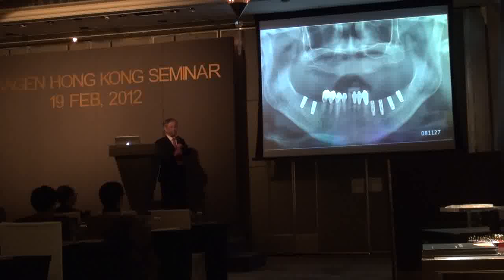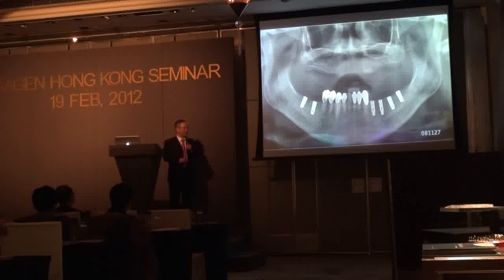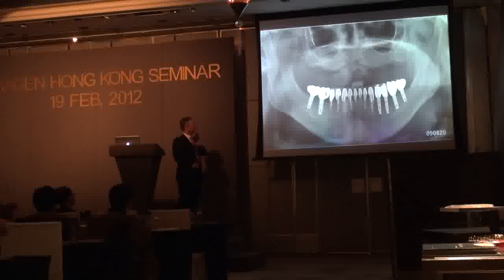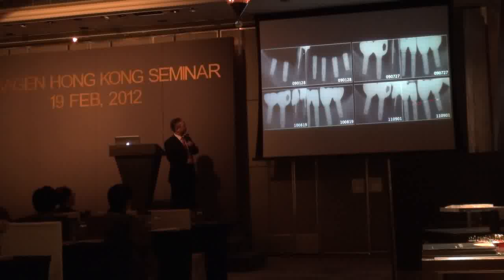So this is one of the first cases with X-Speed treatment. This was started in 2008. At least 3 years have already passed. We tested because the surface change is very, very critical. And with a very nice, very stable result, almost 3 years later, as you see, very stable, no adverse effect. We are testing now how much faster the integration occurs. But on the safety side, there is nothing to lose, nothing bad.